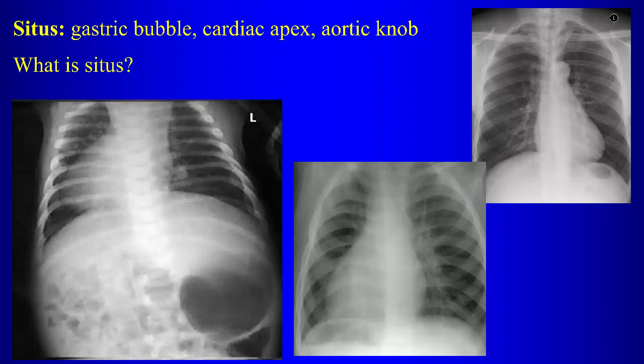With situs solitus, the right atrium is on the right side. It's on the same side of the body as the liver and the trilobed lung. The left atrium is on the left side, or to the left of the right atrium, really, and it's on the same side of the body, usually, as the spleen and the bilobed lung. The ventricles can be on either side, and we'll get into that in more detail later on. But when you're talking about situs for the heart, you're talking about the configuration of the atria, okay? That's because it's very early in embryology when the pulmonary veins develop their connections to the left atrium and the inferior vena cava develops its connection to the right atrium, all right?